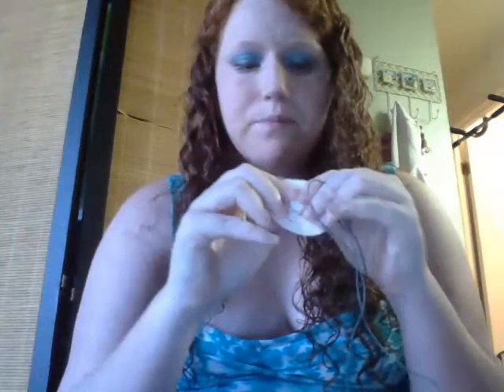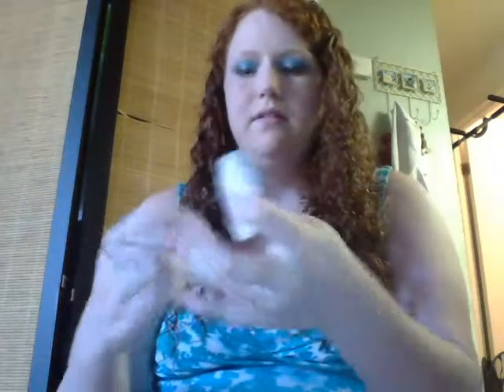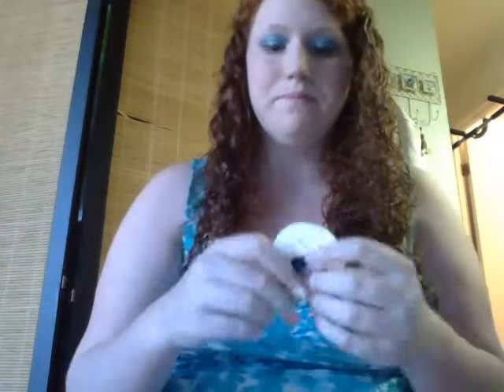I wanted to demonstrate how you put this on. There's a couple ways to do it. I'm just going to do it the simplest way. Take your little patches here, put them there, and then get another one. Connect to the other side. They're clearly labeled left and right. On mine, the right one is the white one, and the left one is the black one. And then this just peels off, right there.